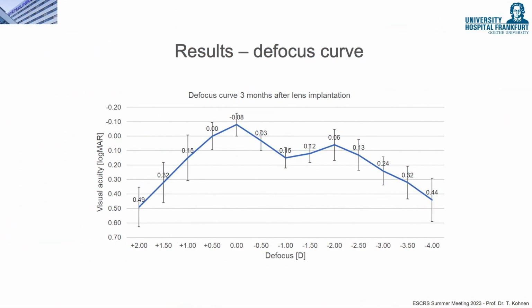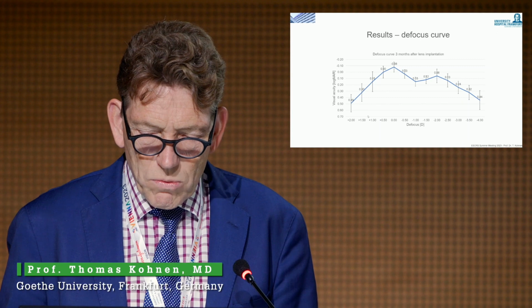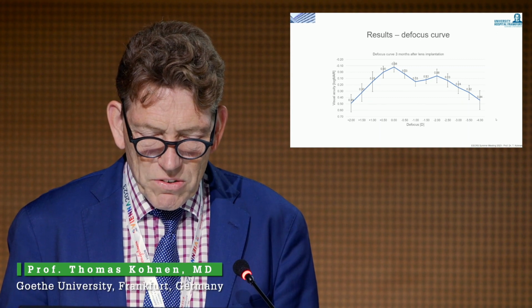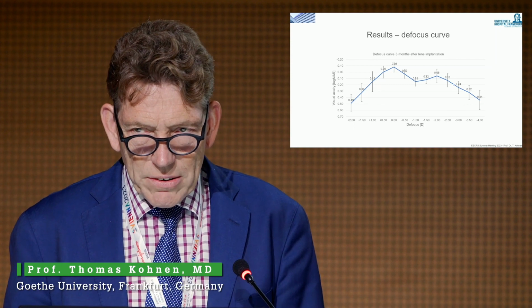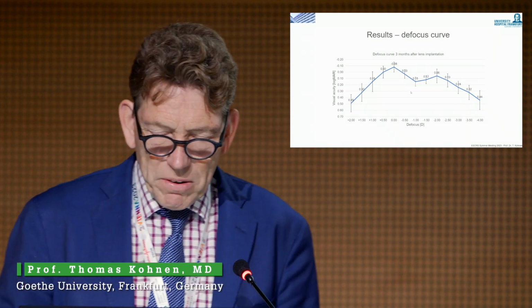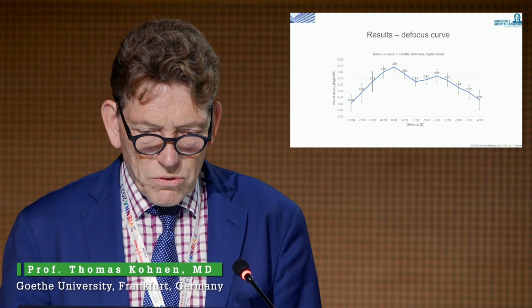This is an important slide. That is our defocus curve. This usually tells me pretty much our lens works, because if I see the defocus curve, which is a lot of effort, you see here that our team refracts them from +2 down to -4, goes all the line with half a diopter steps, and you can see that basically this curve follows a pretty good line. You have only this little intermediate dip in the area of -1, but beside this you have pretty good outcome at the 3 months post-operative defocus curve.